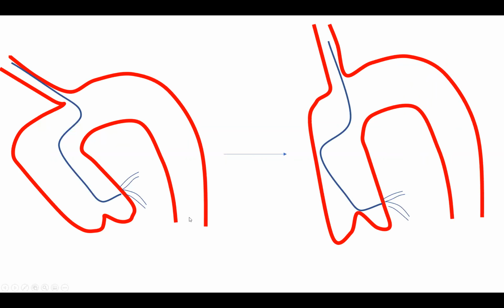Okay. So here's the thing, deep breath. Deep breath can work. Why? I explained it. Deep breath elongates the chest, and it makes your left main more horizontal. And in case of separate ostia or short left main, it will also make your LAD more downward and more horizontal. So if that Judkins left 3.5 was pointing in the circ, now I take a deep breath, I pull the LAD down, and now the LAD is more down, so that downward pointing catheter will end up hooking the LAD. So deep breath can work.